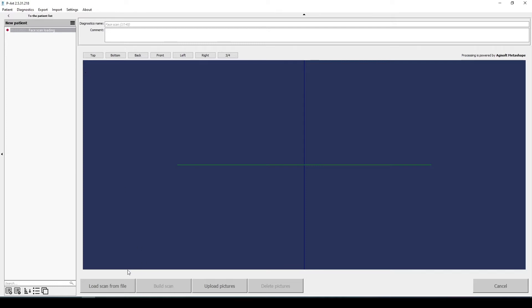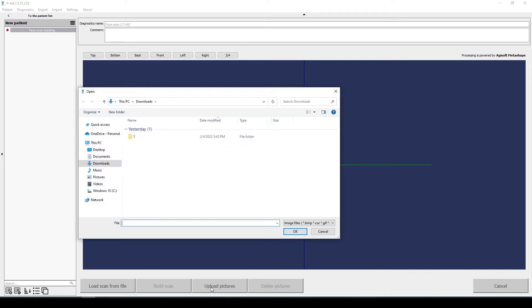There are two ways: upload finished face scan after scanning or use the required number of photos. We are using the second way and upload photos.